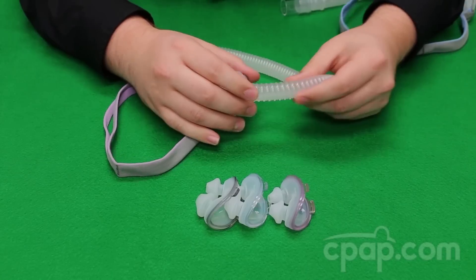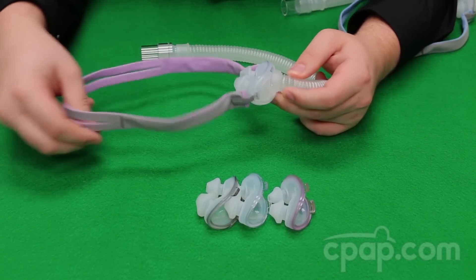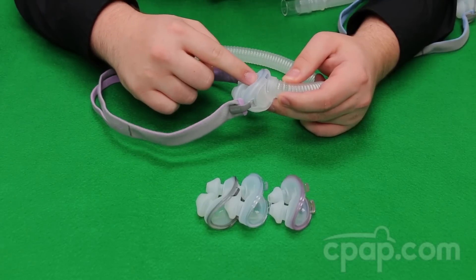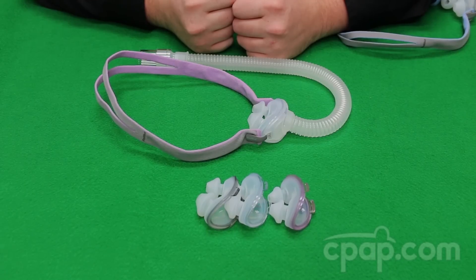Both masks come with the short flexi tube, the vent frame, the headgear, and the three sizes of nasal pillows. For more information about the AirFit P10 and other products, visit us at CPAP.com or give us a call at 800-356-5221.